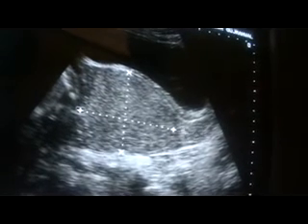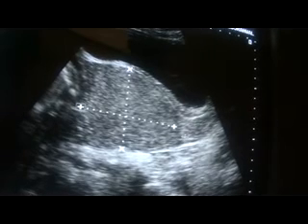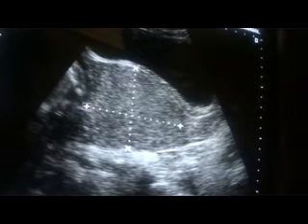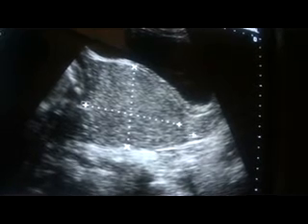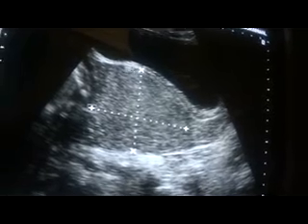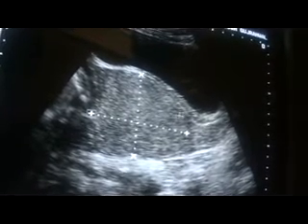This is the anterior wall of the cervix, with no significant degree of posterior acoustic enhancement, and it starts from the most posterior part of the cervix. Here I am trying to align the vagina with this area.